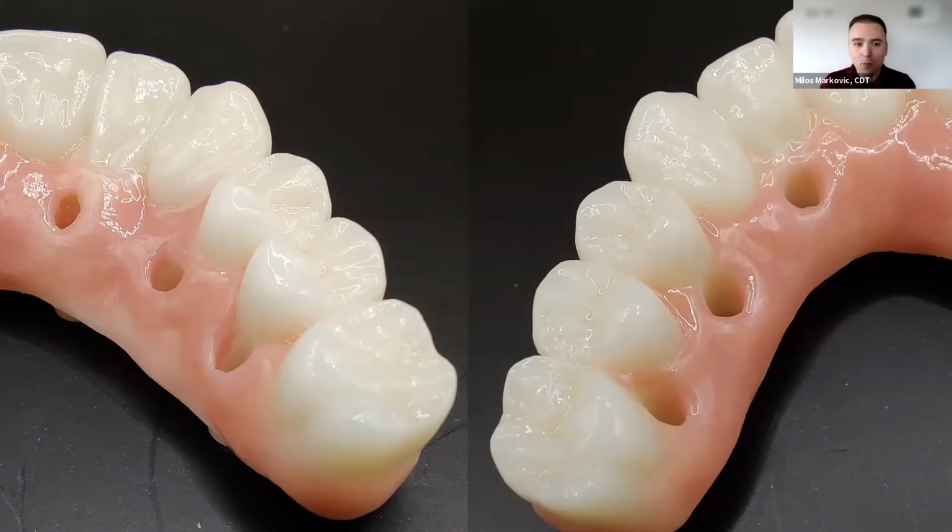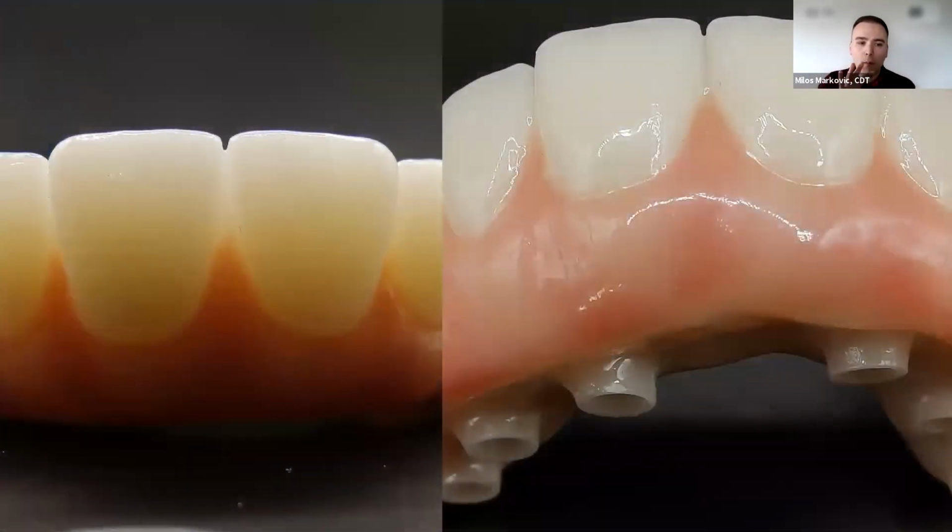As you can see here, we have some really good translucency, really good light reflection. That pink really comes to life with the material. Over here, I took a couple of shots because I wanted to show you how the light shines through the material there on the left-hand side. And then here, an angled shot where you can see the purple, pinkish halo that always exists around the pink layered restorations shining through right at the gingiva and the transition between the two, transition, no pun intended.